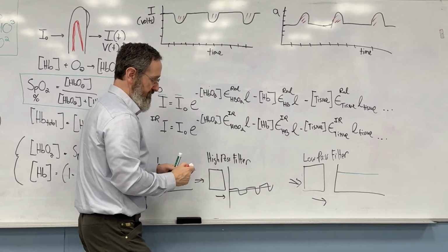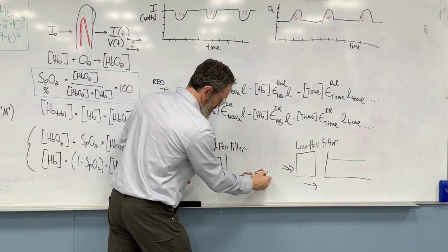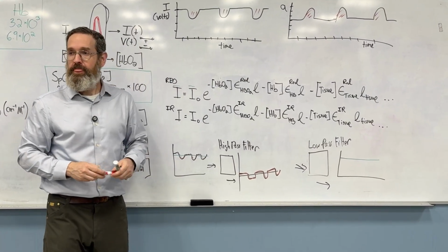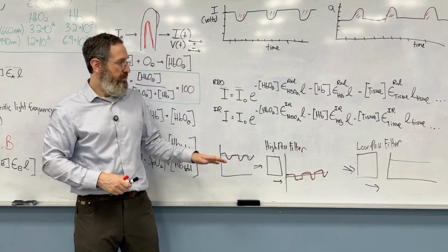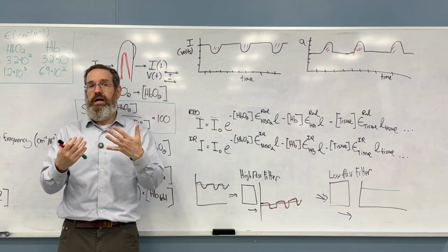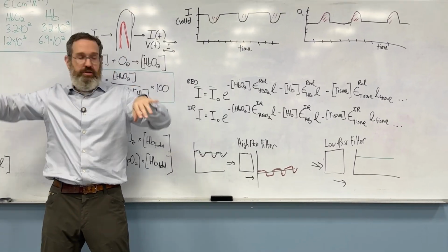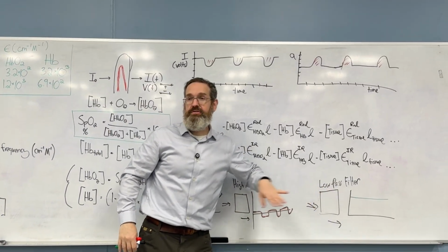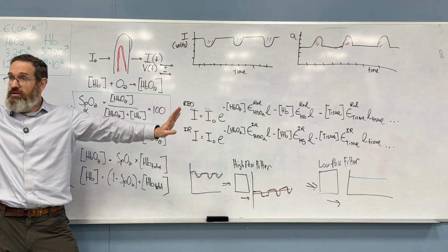And I used red here for this. That's the intuition. Is there math to it? Yeah, there is some math to it. But that's the intuition that filters allow us to strip fast changing, slow changing. In fact, you could do both of these: fast changing goes here, slow changing goes here. Okay.